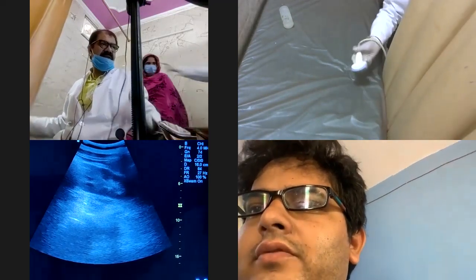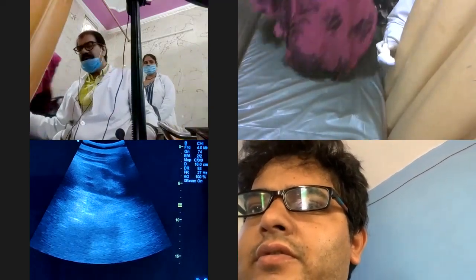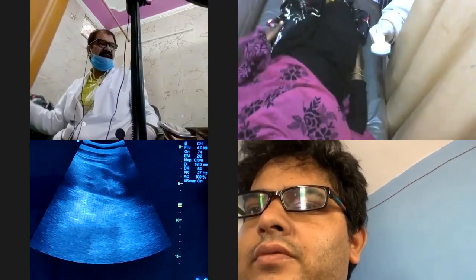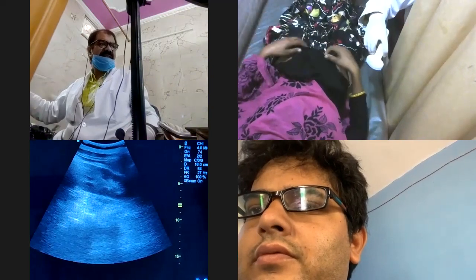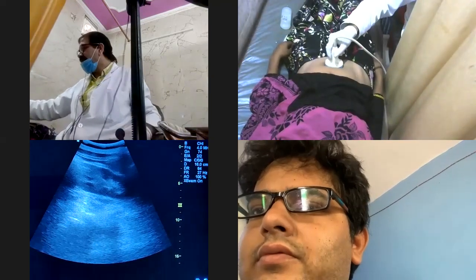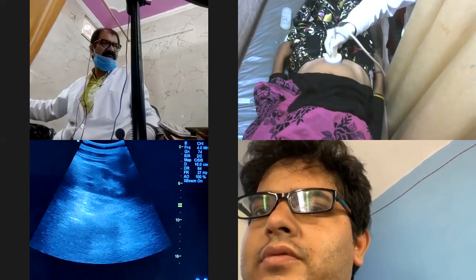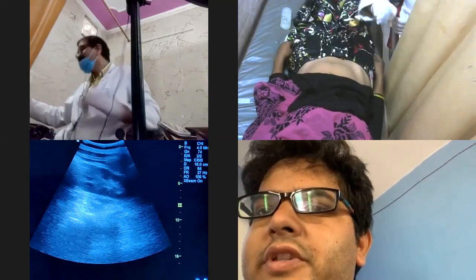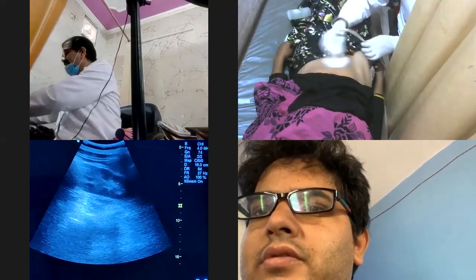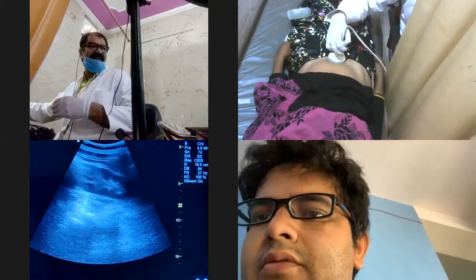Now see, this is the probe over here. Can you see the probe? Yes sir. Now tell me how to put the probe in a transverse section. Is it like this or like this? This way sir. How can you say this way, not that way? What will decide, this way or that way?